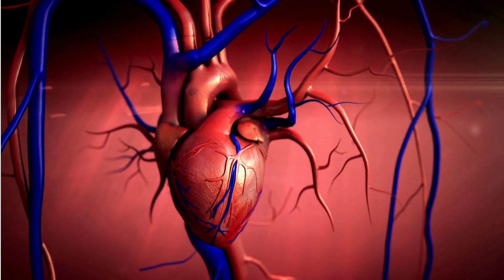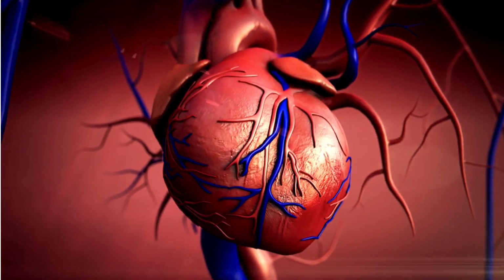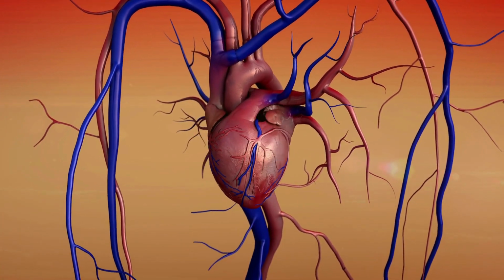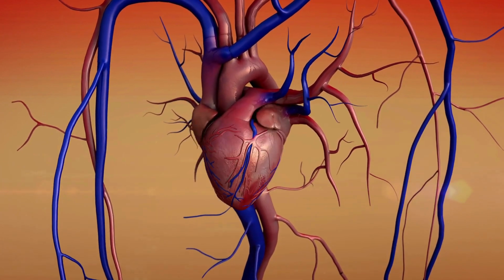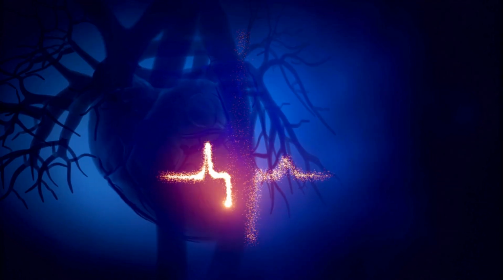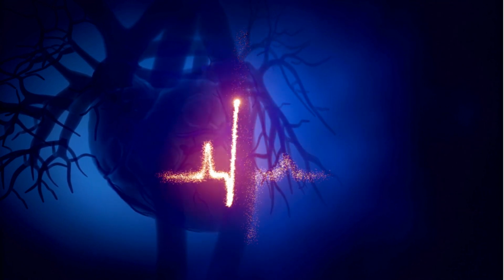Angioplasty. Purpose: to open narrowed or blocked blood vessels. Procedure: a catheter with a deflated balloon at its tip is advanced to the narrowed or blocked area. The balloon is inflated, compressing the plaque or blockage against the vessel wall and widening the artery. In some cases, a stent, a small mesh tube, may be inserted and expanded to help keep the artery open.